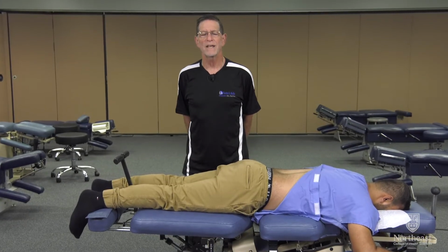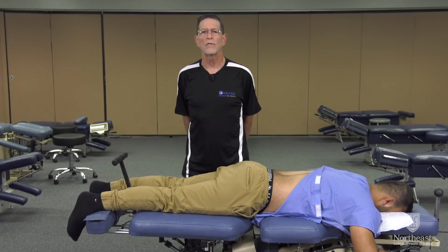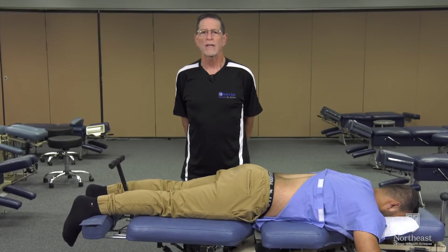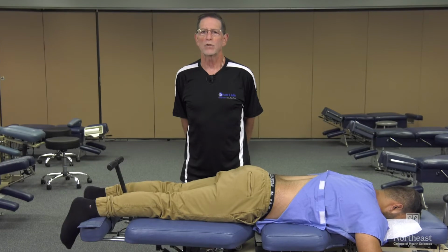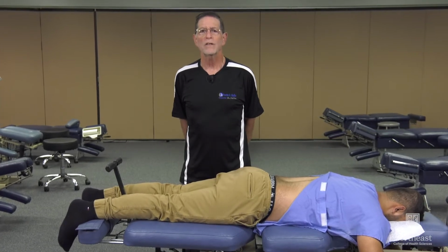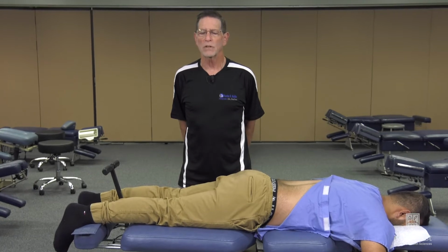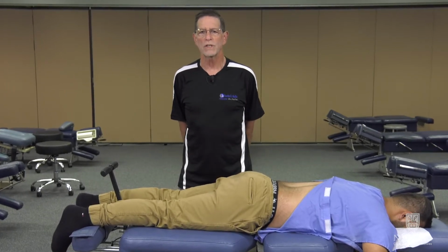This is a technique that is used to treat a variety of different types of spinal disorders, especially patients with disc problems and joint issues. The technique utilizes a specialized table that allows the doctor to apply different forces in different directions to the spine.